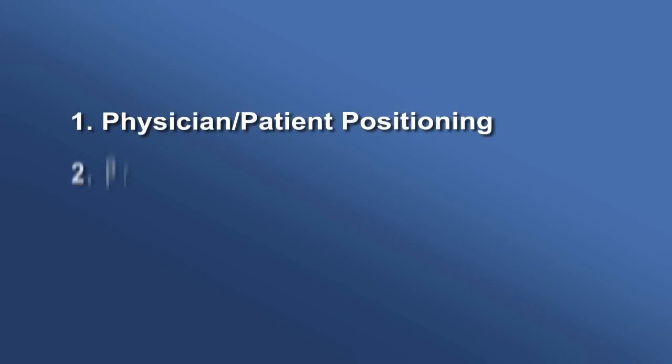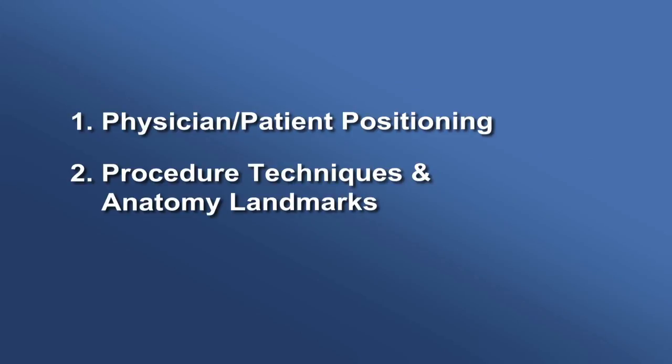Physician-patient positioning. Procedure techniques and anatomy landmarks. And patient preparation.